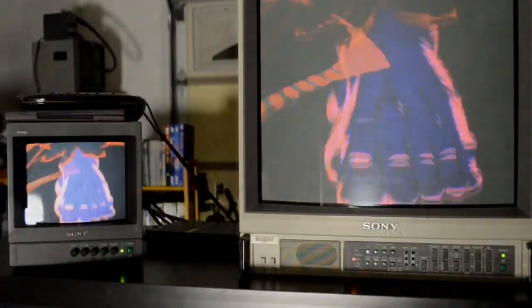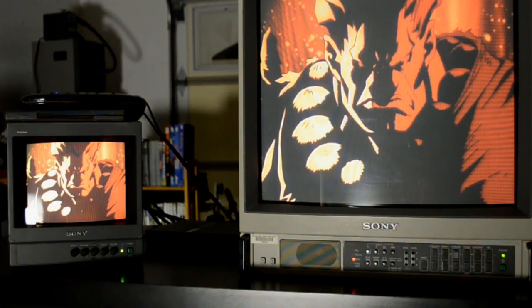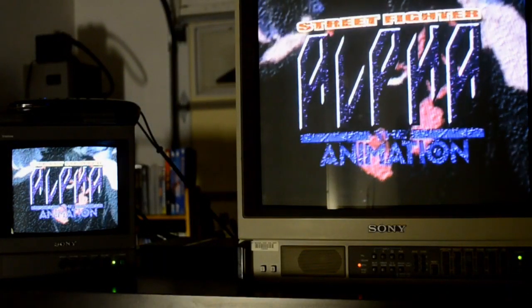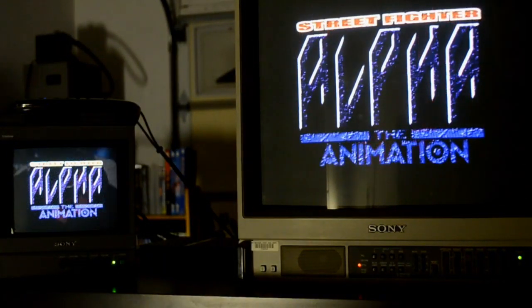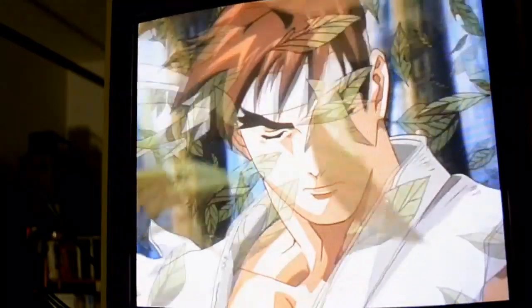And so that's why I had the 8220 here, because it's just a little PVM that does S-video and composite. So it's a good idea to run the DVD player through it and then loop that through the Sony PVM 1943MD. So again, this is a medical version of this monitor. It came out really well. I think the picture looks pretty good.